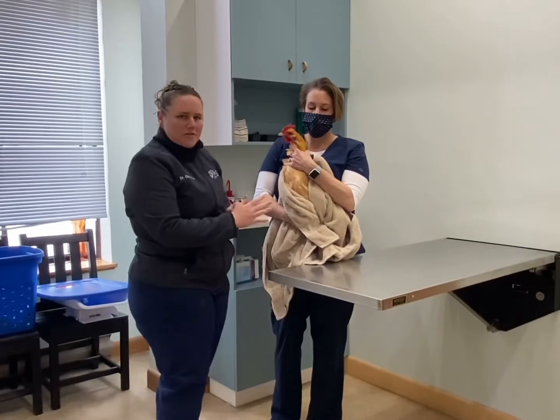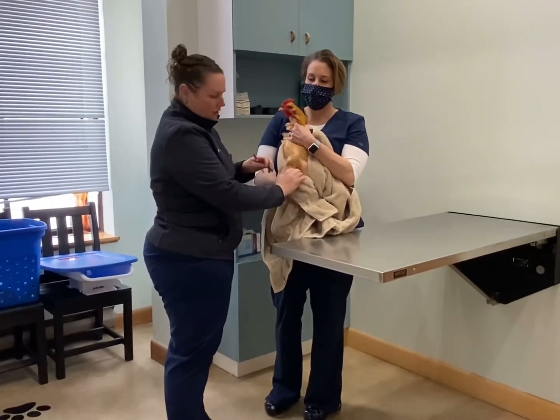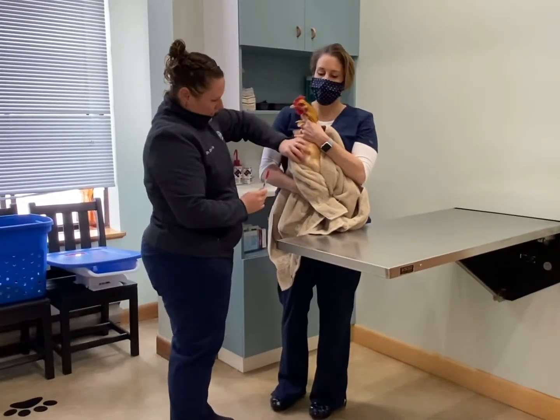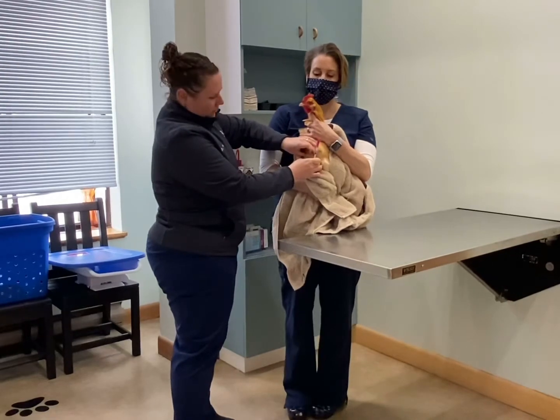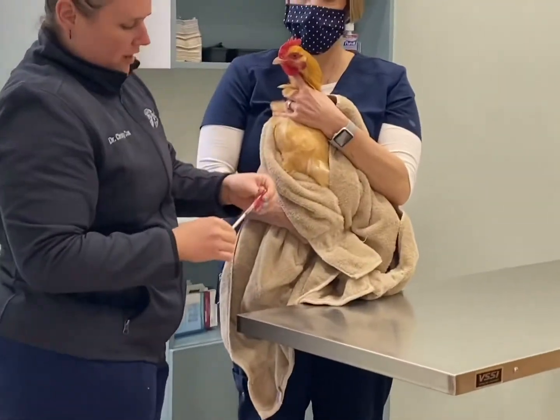With one person holding her with the chicken's back to her front, we have exposed the keel bone — that nice long bone in the front. You're going to feel along that bone, and either side of it there's muscle. You'll feel that nice soft muscle, and you're going to be alternating sides each time you give the injection.